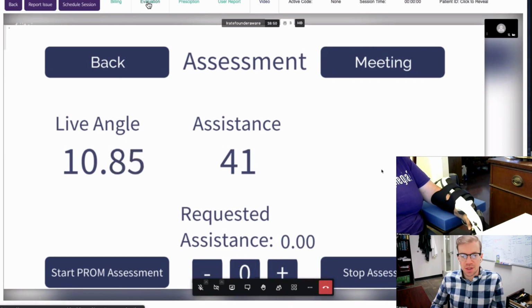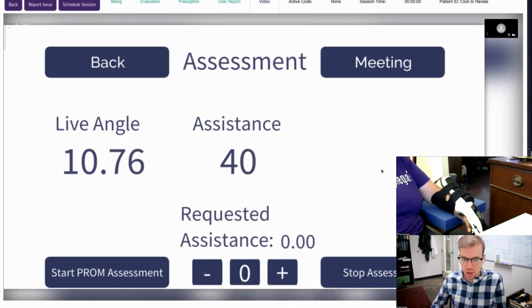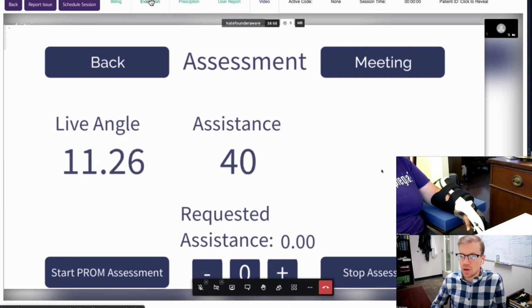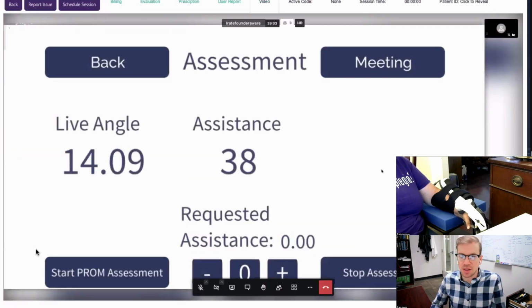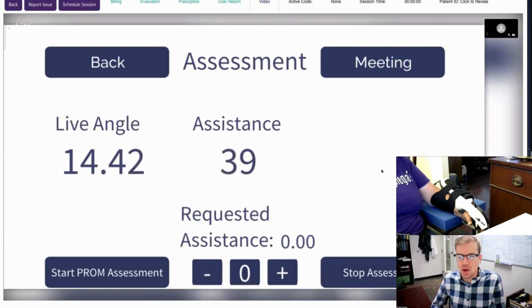So I think what you're talking about here is there's some weakness that happens, and that's okay. As that assistance goes up, the forces are going up, and that's expected. So from here, I'm going to have you try to extend as much as you can. Okay. And also, I wonder if you can see this.